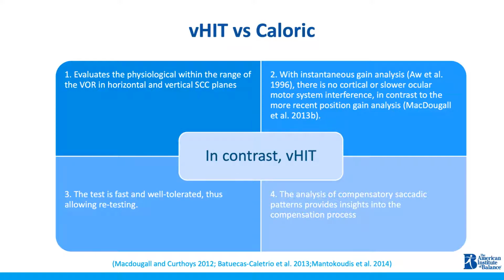So to recap, what you know from your testing is that this patient has likely had a left unilateral vestibulopathy and shows compensation throughout all of your testing. So why does your patient still have the functional impairment of oscillopsia, which was the vision blurring during quick head movements? This is the point where vHIT is helpful in generating some more objective information regarding this patient's compensation status. vHIT testing tests around 3 to 5 Hz. This is a higher frequency than you've tested throughout your comprehensive vestibular evaluation, and it's much closer in replicating the functional impairment that your patient's complaining of.